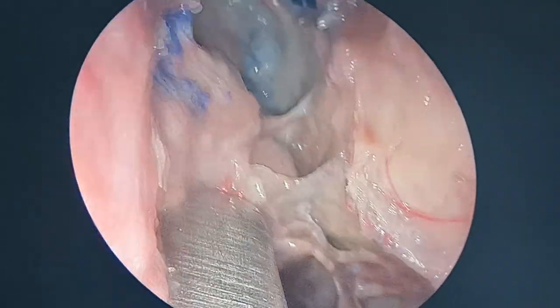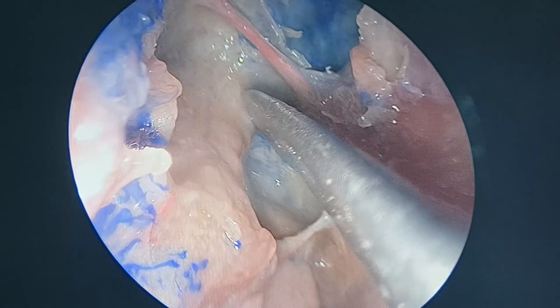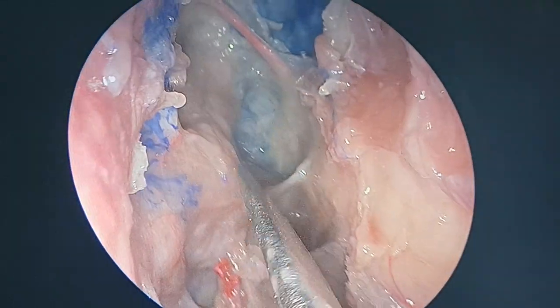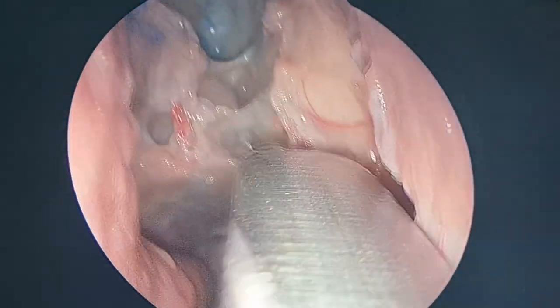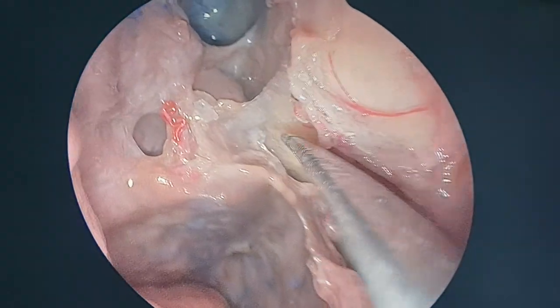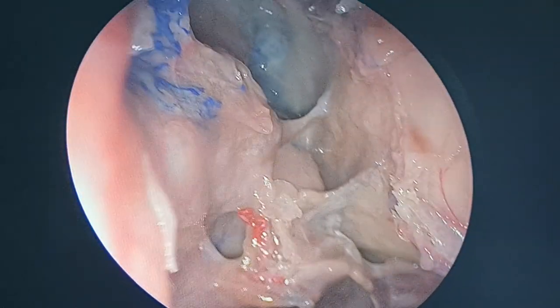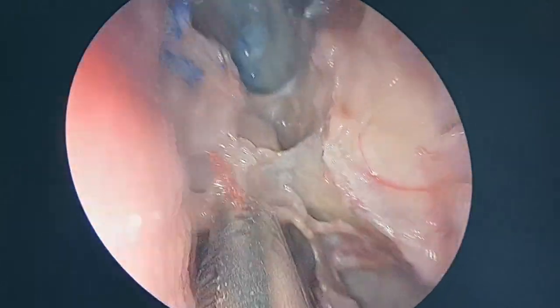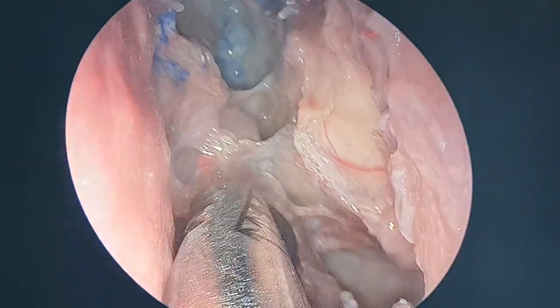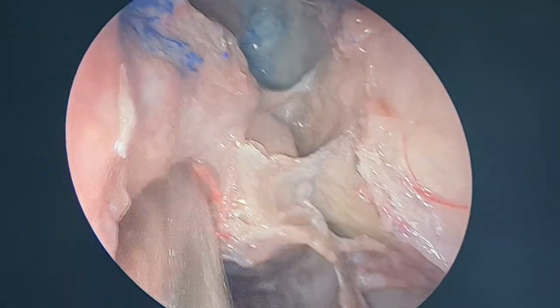Why? Suppose I go above and make the entry, what can happen? See where the skull base is. If I go above and make the entry above, I can easily hit the skull base and I'm disoriented. So to prevent your disorientation, stay in the line of the orbital floor or the maxillary roof, call it the maxillary line. And now medially, close to where the first part is becoming the second part, and close to here, I will enter into the ground lamella.